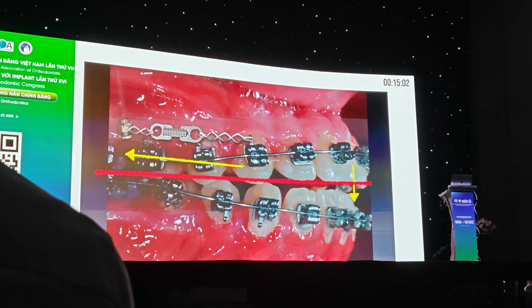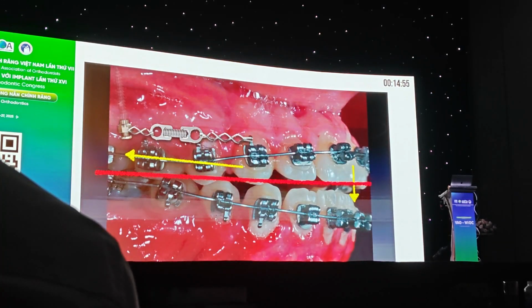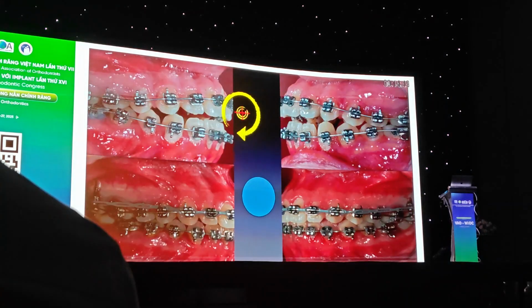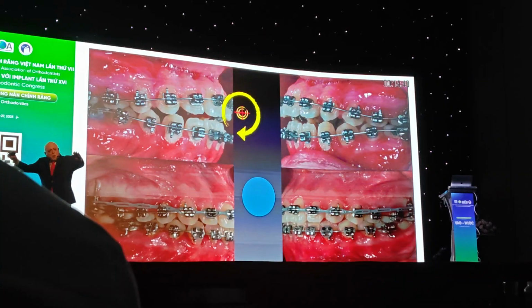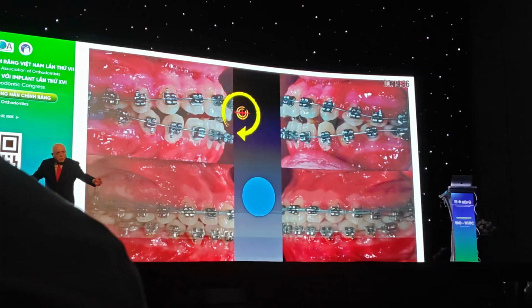So take a look at it. Using the biomechanics system, he has determined an occlusal plane, and he would like to extrude the anterior teeth, maybe extrude the lowers a little bit, and at the same time, he wants to work on the basis of where the center of resistance of the upper arch and lower arches is, and how we are going to apply a force where the whole upper arch is going to come down, maintain the lower arch, finish up the patient.